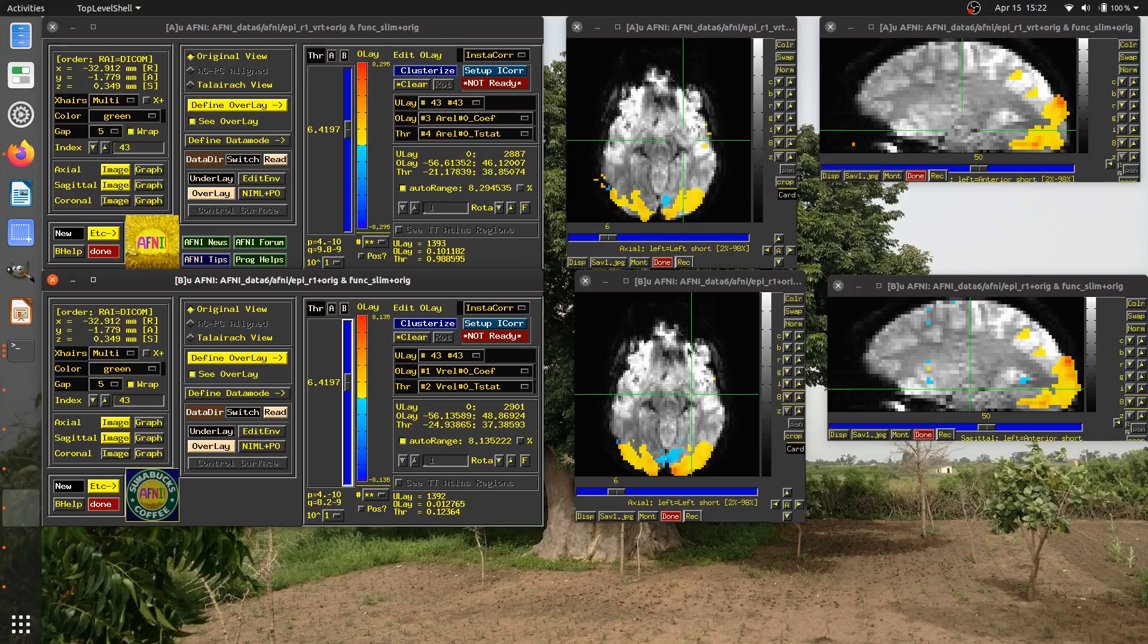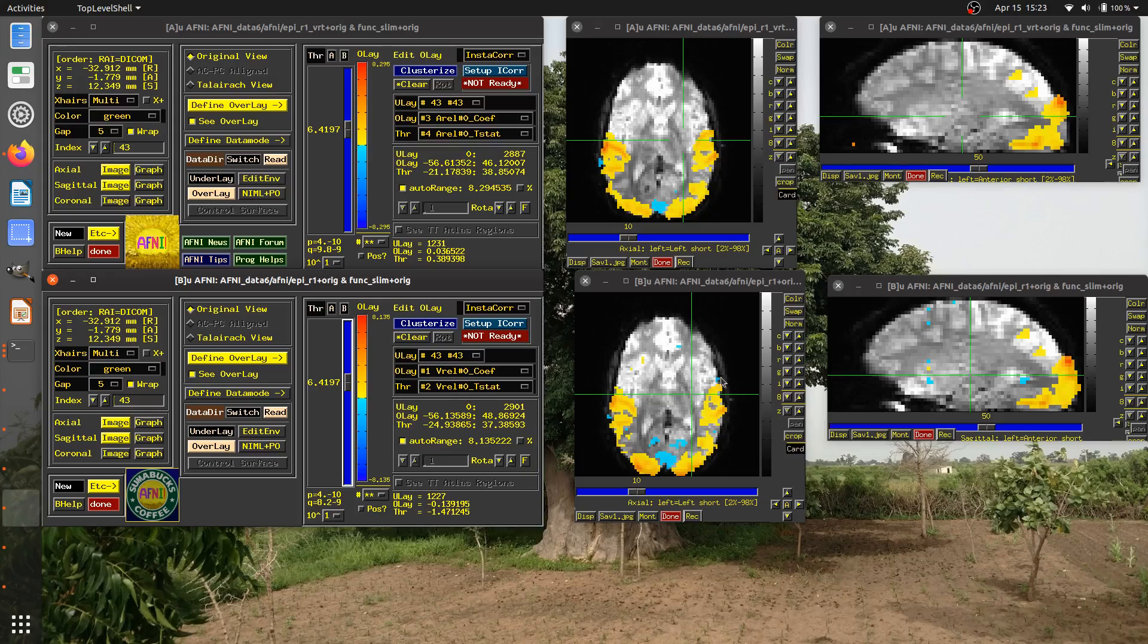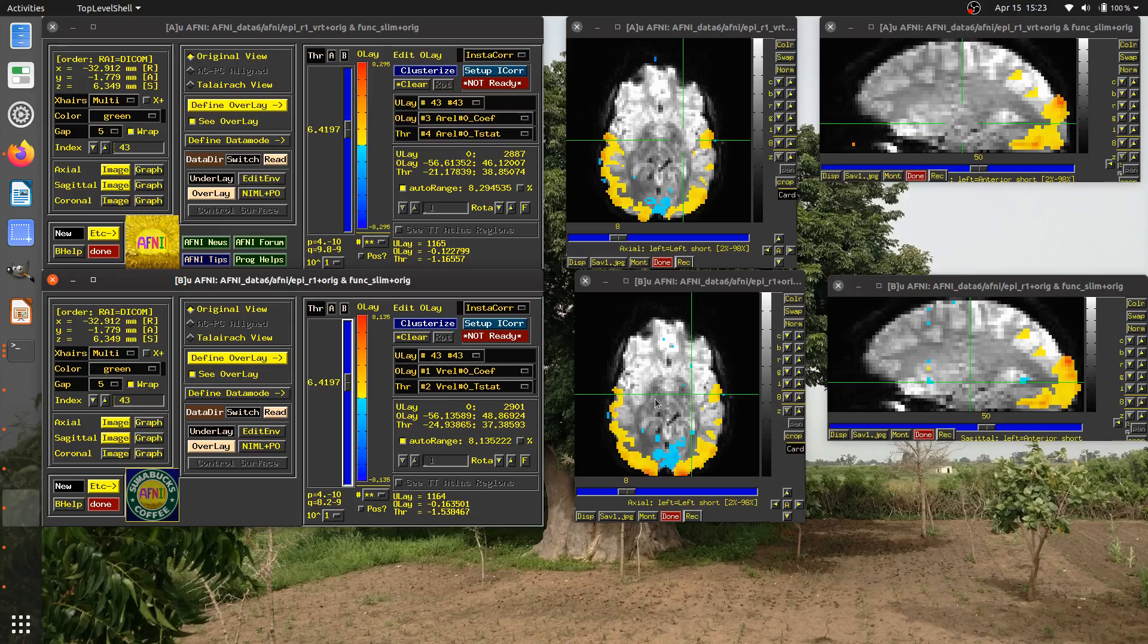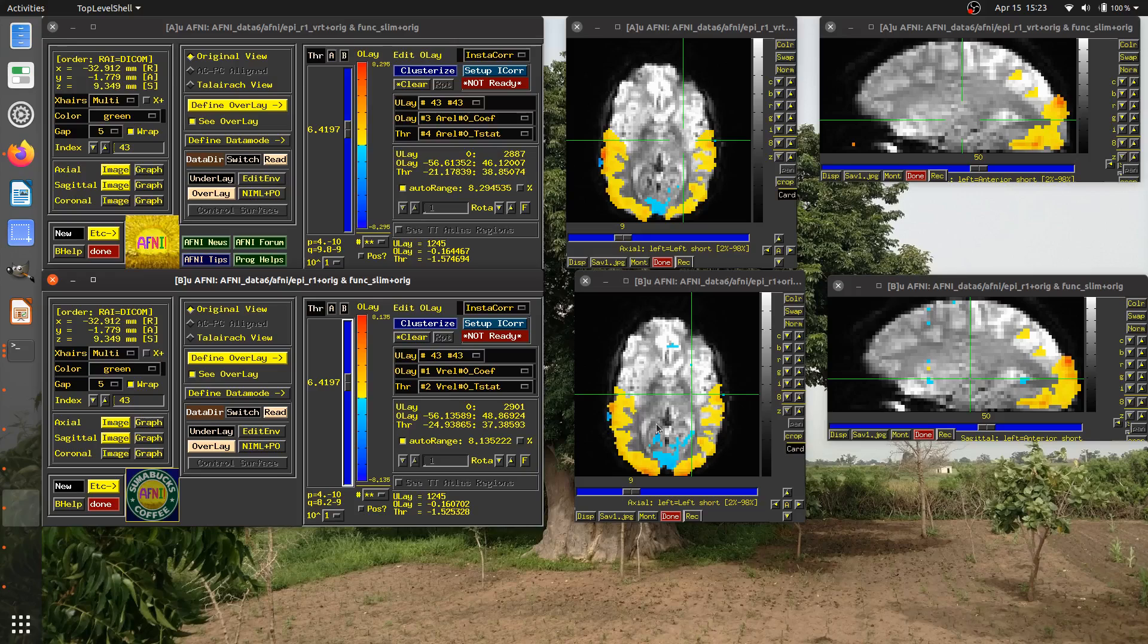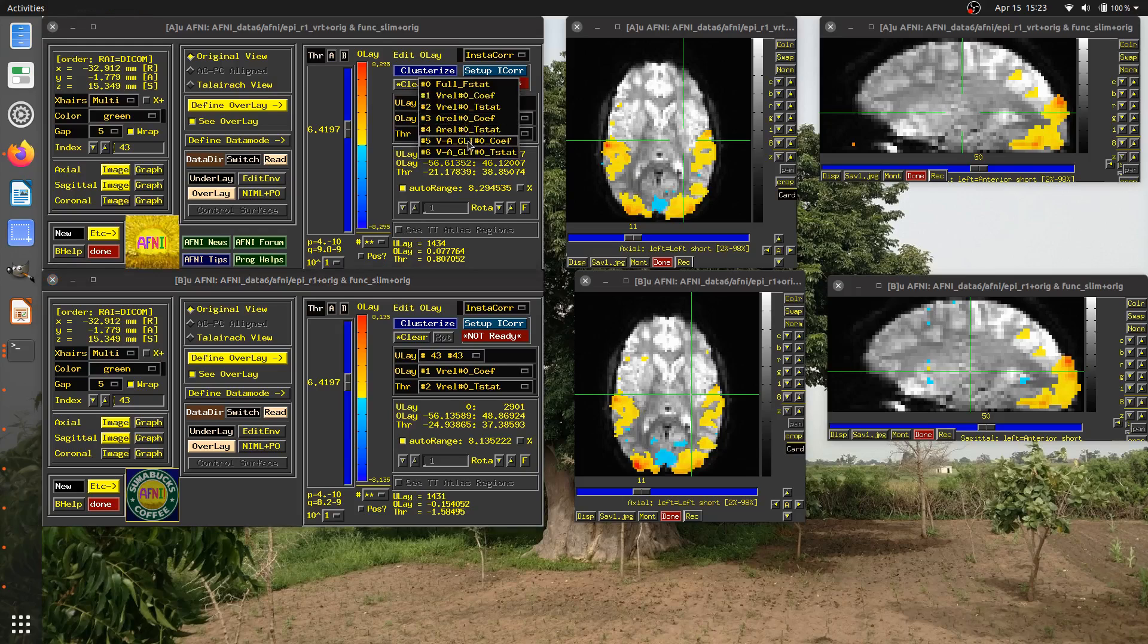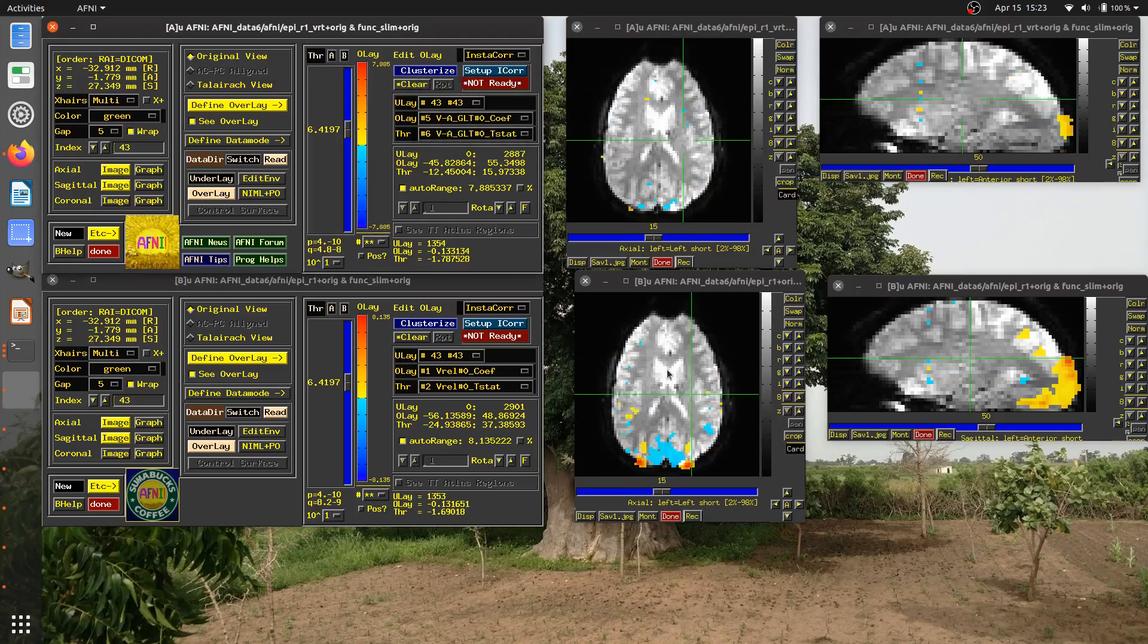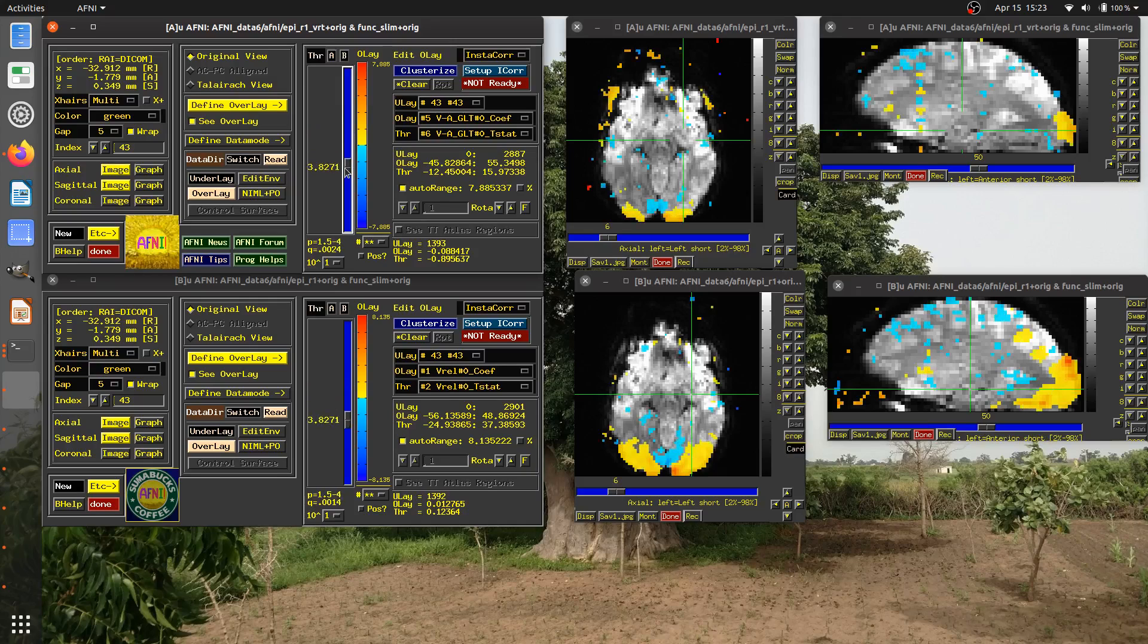And again, it doesn't look like anything changed here, but let me click in this dataset and move the threshold here. Now, if you notice, as I move the threshold here, the same threshold value is being applied here. So they're still locked spatially. And if I increase the threshold here, let me increase it more so the differences are a little more apparent. You can see these are different spatial maps. It's fairly subtle here, actually, because this visual reliable and audio reliable, each task has an audio and a visual component.